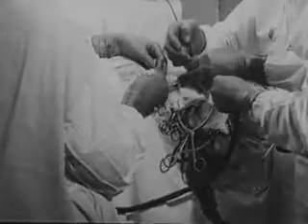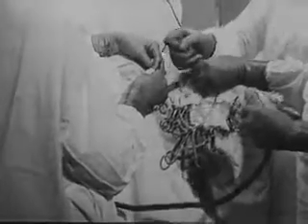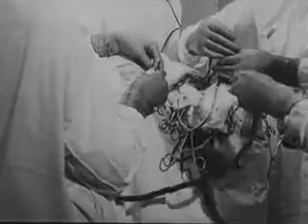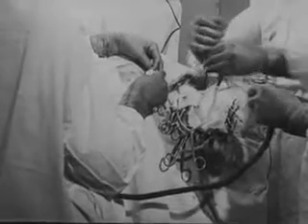Not only has the method proved a benefit to the patient and the anaesthetist in the protection it affords to the airway, it has considerably increased the scope of surgery in the region of the head and neck.